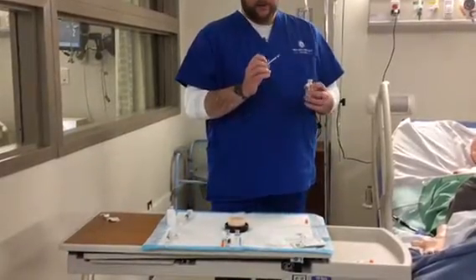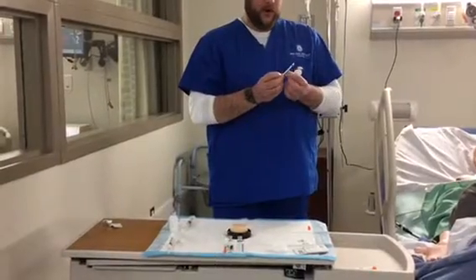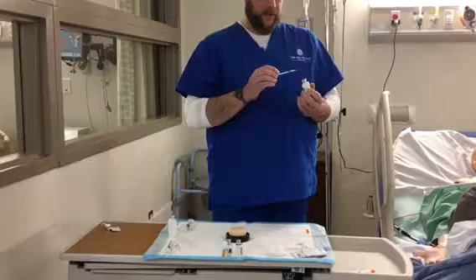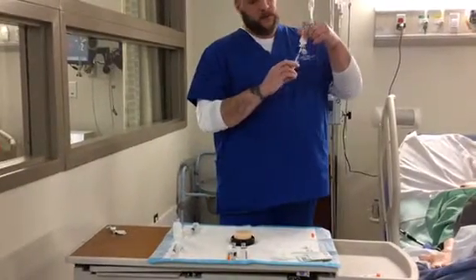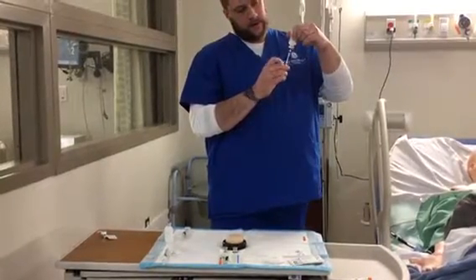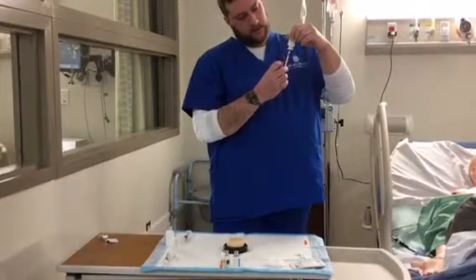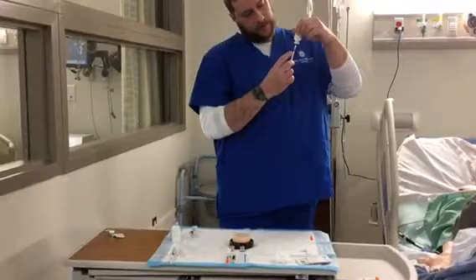For this one, say we want to do 10 units. We will withdraw 10 units of air, placing into the vial. You want to inject the 10 of air, and then withdraw 10 of the medication, making sure that there's no air bubbles.